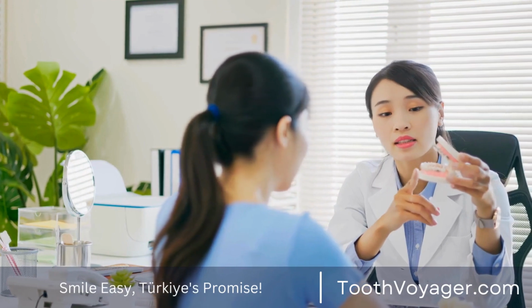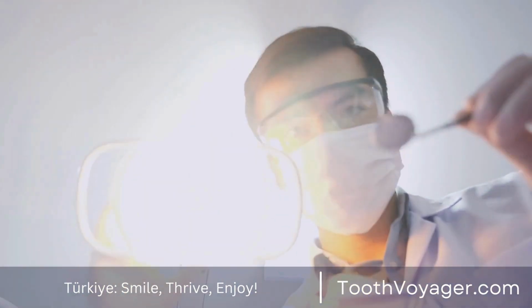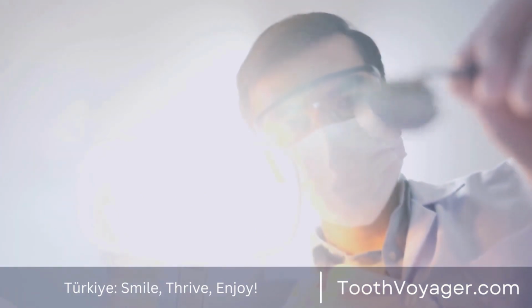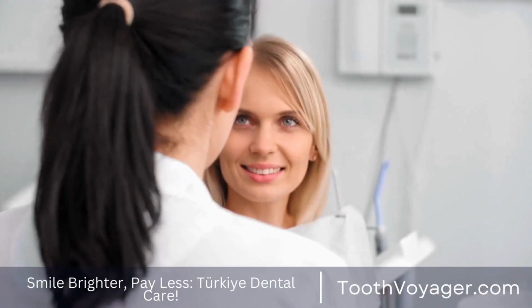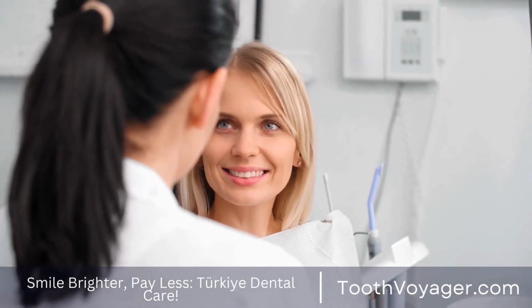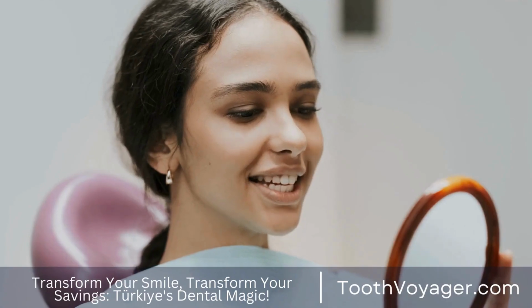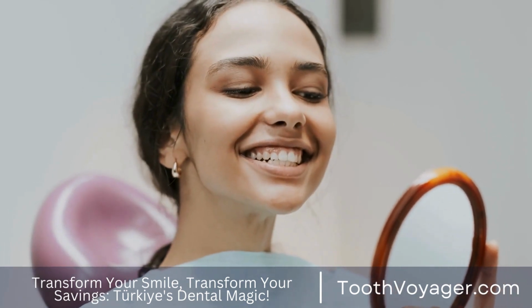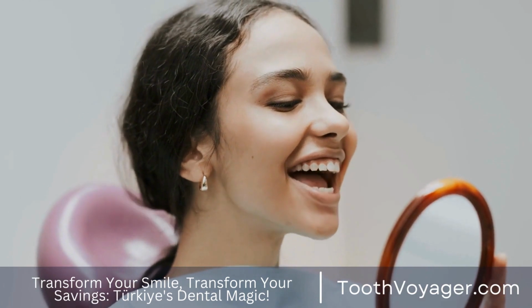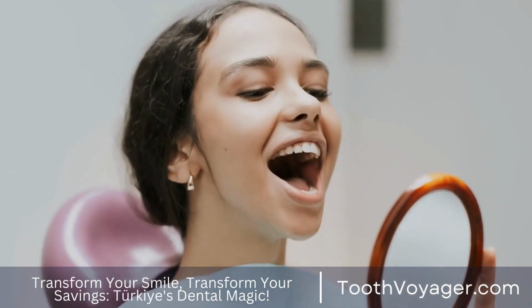What is a dental crown? Crowns that resemble teeth are cap-like devices that are put on top of teeth to restore their dimension, strength, appearance, and shape. They're made of many different materials such as porcelain, metal, ceramic, and resin. Every material comes with its distinct advantages and disadvantages, which is why it's crucial to speak with your dentist in order to choose which material is best suited to your specific requirements.